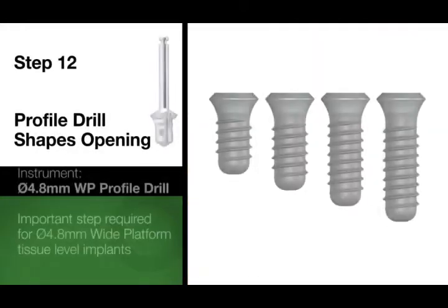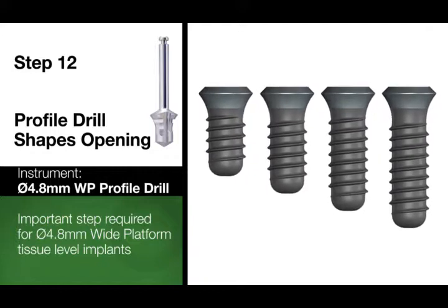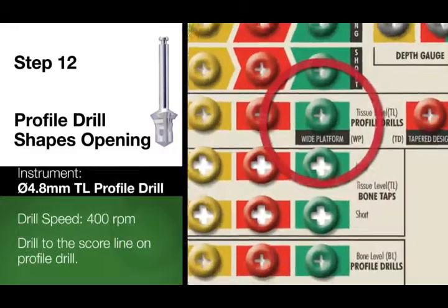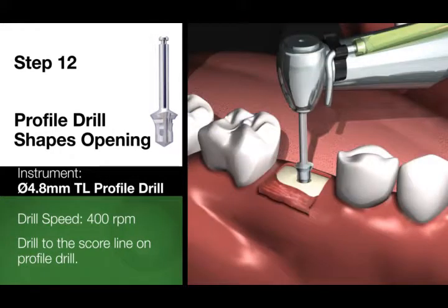Step 12. This is an important step required when drilling the profile for a 4.8 mm wide platform OCTAGON tissue level implant. Choose the 4.8 mm tissue level profile drill. With copious irrigation and a motor speed of 400 RPM, drill to the score line on the profile drill.